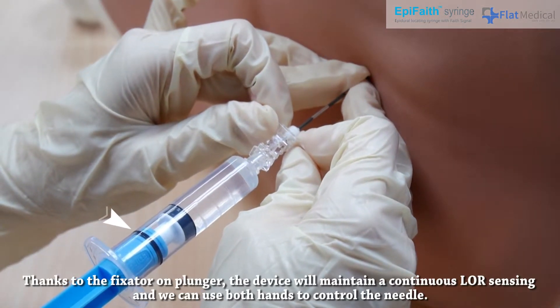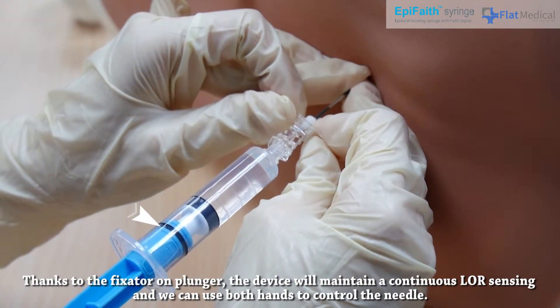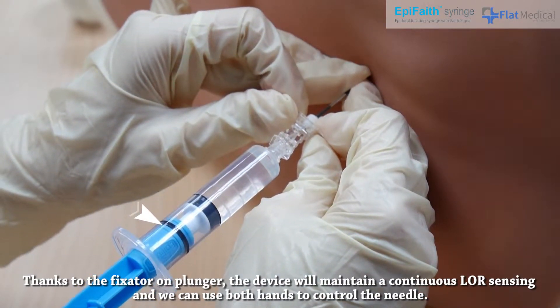Thanks to the fixator on the plunger, the device will maintain continuous loss of resistance sensing and we can use both hands to control the needle.